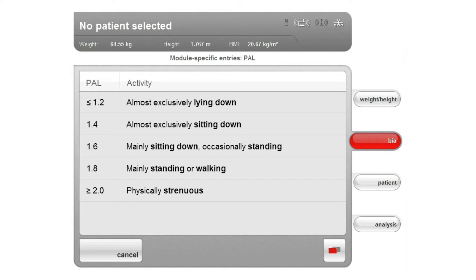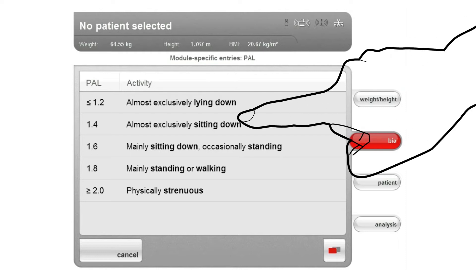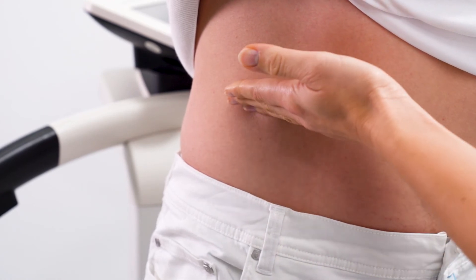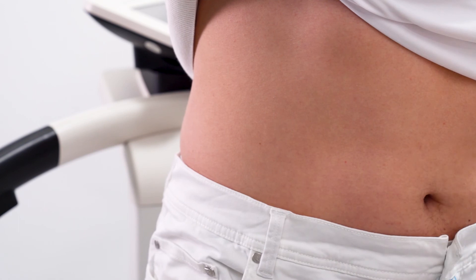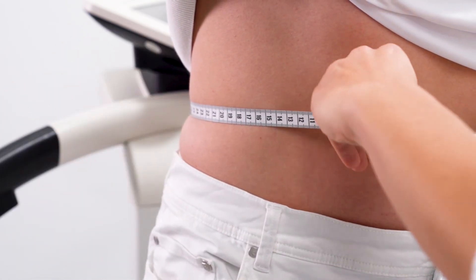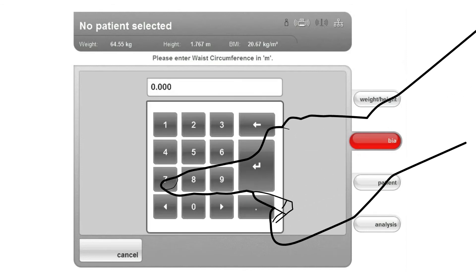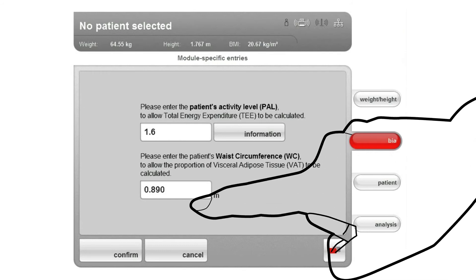Typical PAL values include 1.6 for more activity with predominantly sedentary activities, or 2.0 for very active people who do hard physical work. Normally these values are calculated on the basis of an activity log, which is used to determine an average PAL value. The values on the device serve only as a rough orientation. Enter the appropriate value for the patient. The waist circumference is required for the calculation of visceral fat in the evaluation module Health Risk, and is measured in the middle between the costal arch and the pelvis. If the Health Risk module has not been selected, this entry is skipped. Enter the waist circumference using the number pad and confirm both the PAL value and waist circumference with the corresponding key.